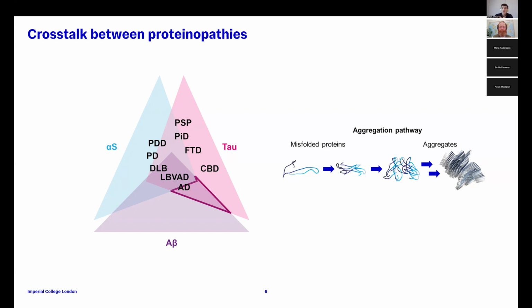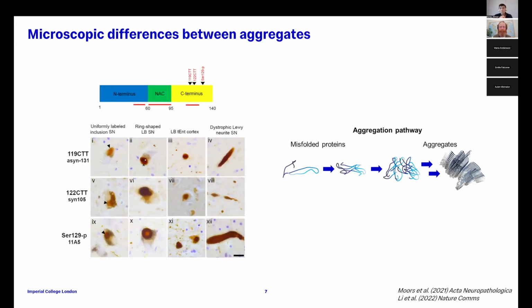But also we need to detect them and classify them accurately. So the canonical way that people have done this historically, including Alzheimer himself, was using microscopy. And here I've just put up an example from the Vandenberg lab, where they've used immunohistochemistry in this particular figure to show that the different antibodies that are targeting different epitopes of alpha-synuclein are exhibiting themselves in all these different kinds of deposits throughout the brain. And this is in Parkinson's disease itself.